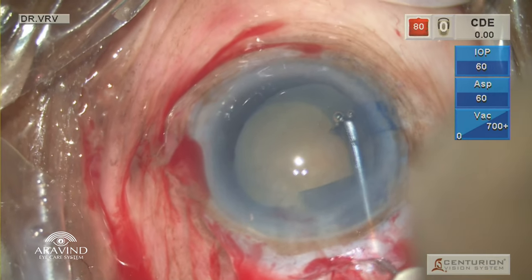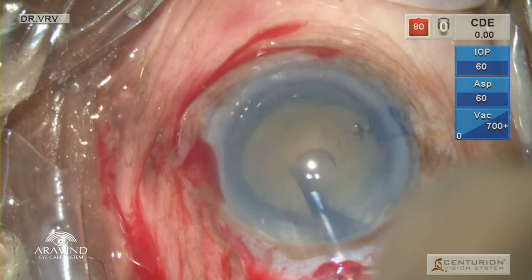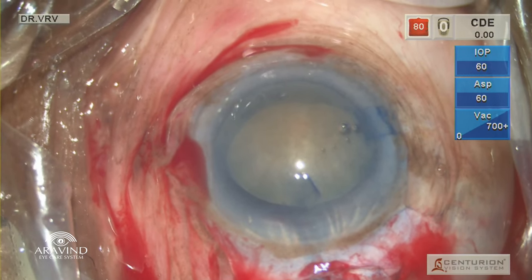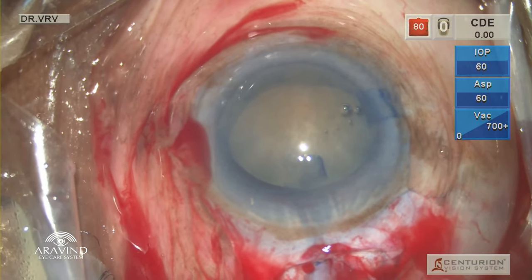So once the rhexis is done, the next step is nucleus delivery. You should understand, in these cases, hydroprolapse does not work, nor hooking out. When you try to hook out, you're going to have slippage. It's going to be like a marble. It's going to keep running in the back.